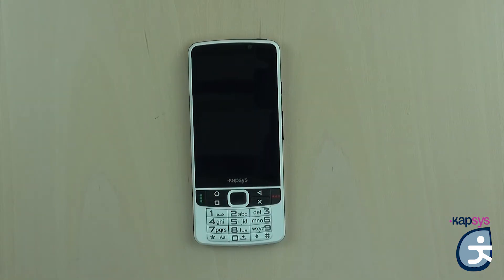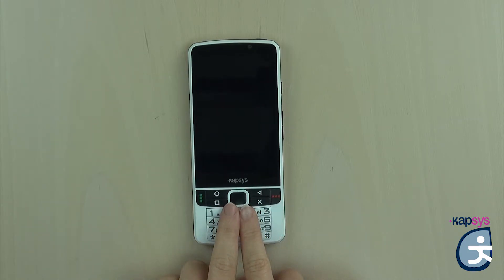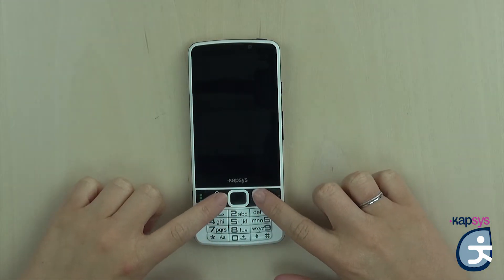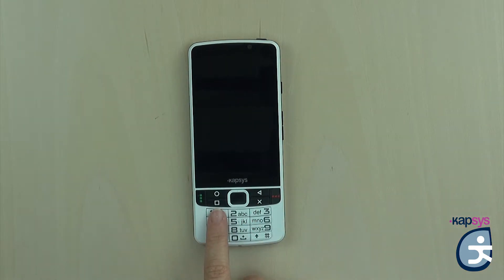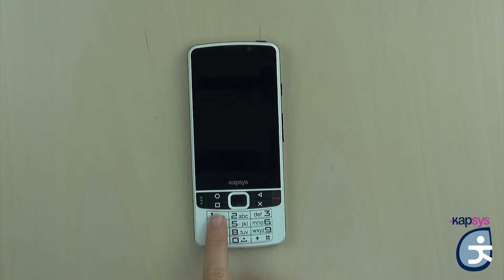Between the central joystick and the pick-up and hang-up keys, you have four Android keys — two on the left and two on the right of the central joystick. The couple of keys on each side is separated by an embossed horizontal bar. On the left of the joystick, on top of the horizontal separation, you have the home screen key symbolized by a circle, which allows you to return to the main page. Below the separation bar, you have the menu key symbolized by a square, which gives you relative options and settings for the opened application.